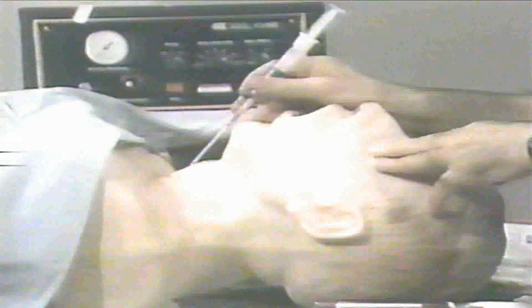Transtracheal jet ventilation. If the patient cannot be intubated and cannot be ventilated by any means, this is a life-saving measure. Transtracheal injection is done, as previously explained. It's nice to puncture the tip of the catheter with little holes. It can be done in a sterile fashion with a glove and a 22 gauge needle. A few holes can be made at the tip of the catheter. This prevents tissue trauma when it's jetting. The catheter should be size 14.